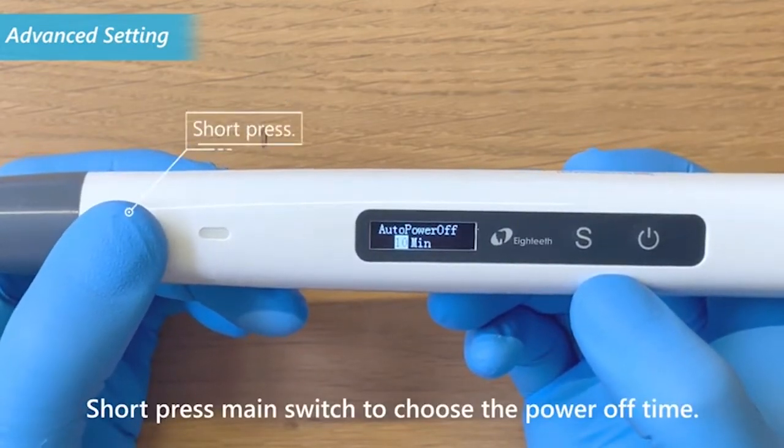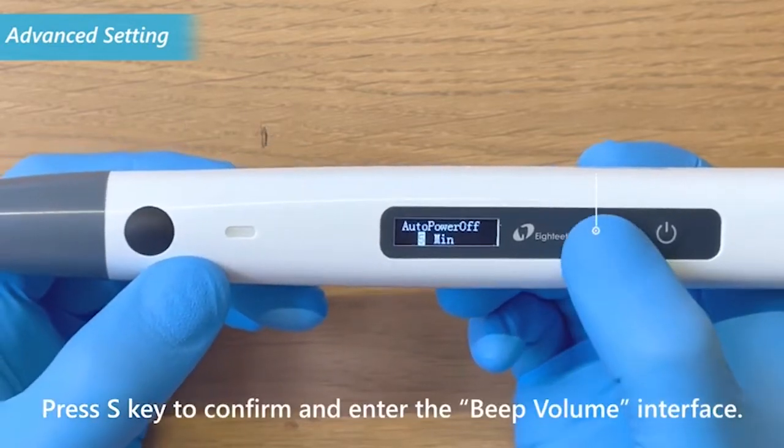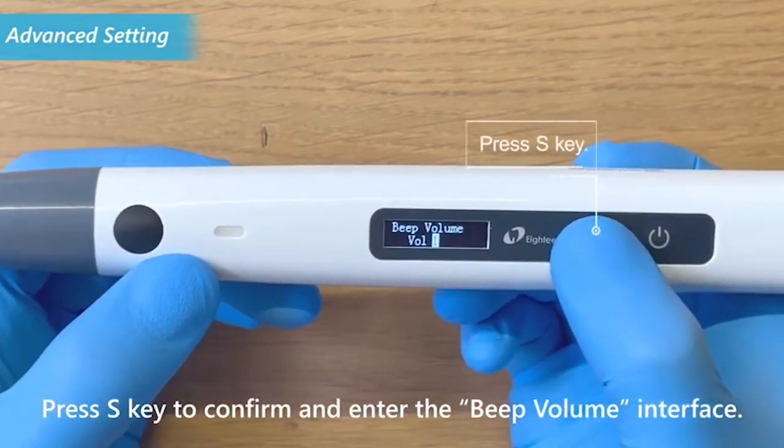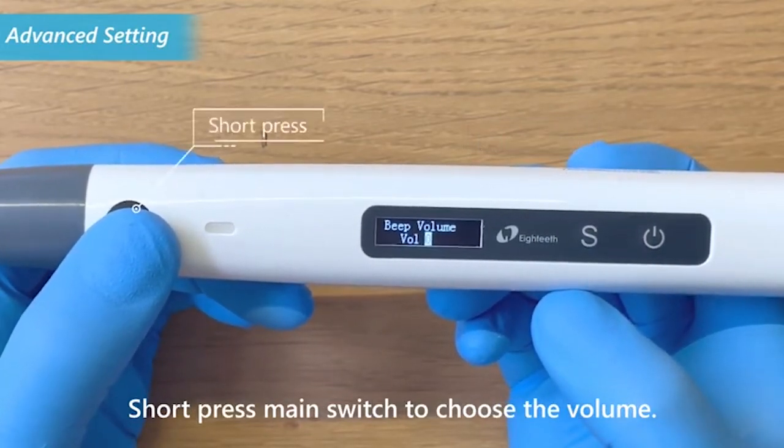Short press the main switch to choose the power-off time. Press the S key to confirm and enter the beep volume interface. Short press the main switch to choose the volume.